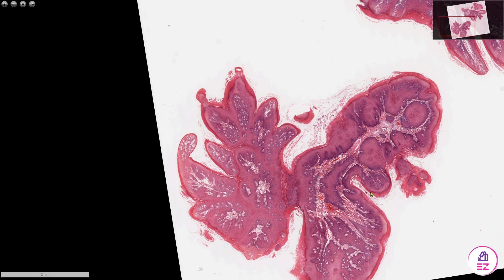This is quite a straightforward pathology. Within the oral cavity, the squamous cell papillomas that you see tend to be quite cauliflower-like, and that's mirrored in the contour we're seeing in this biopsy. The mucosa is very folded and has a marked papilliferous outline with fronds of mucosa projecting outwards.